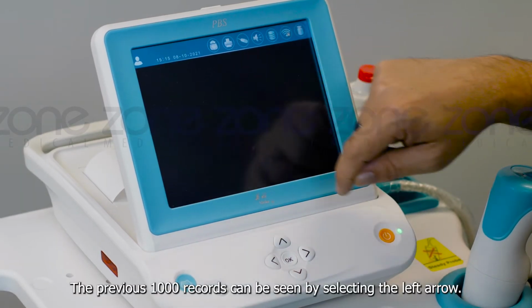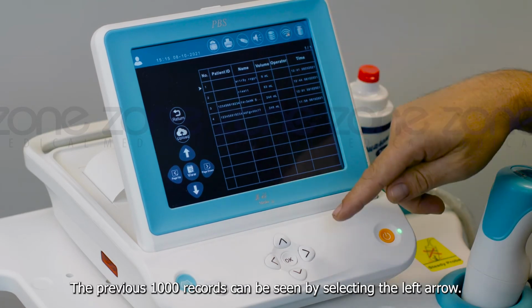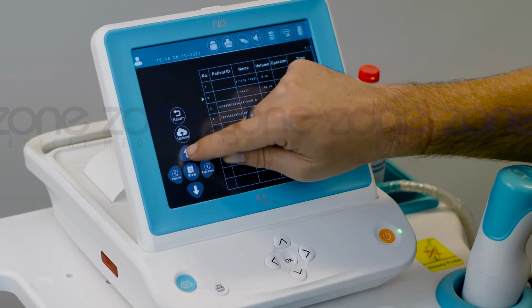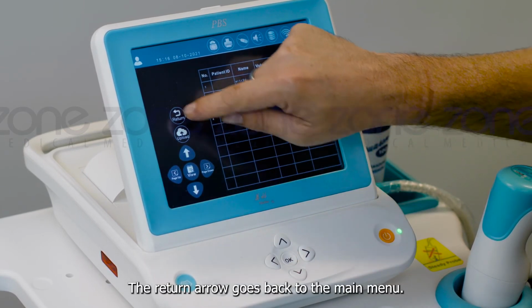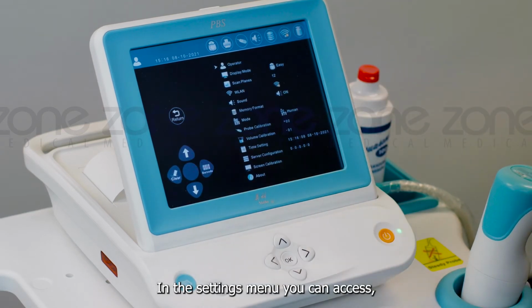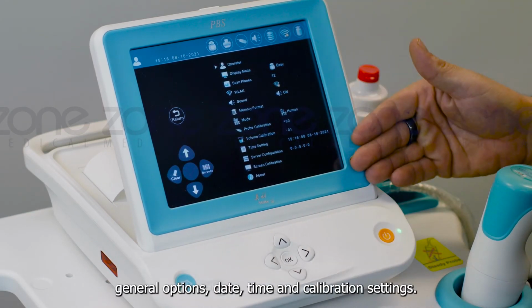The previous 1000 records can be seen by selecting the left arrow. Navigation is done via the top and bottom arrows. The return arrow goes back to the main menu. In the settings menu you can access general options, date, time and calibration settings.